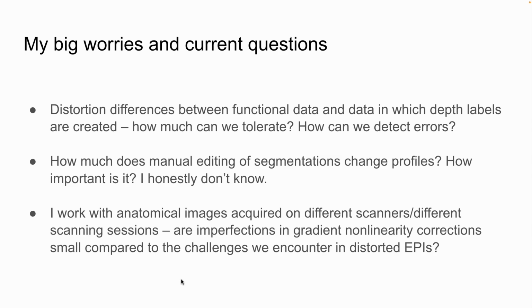And that's been kind of a guiding principle for me. And maybe it's sheer laziness, I don't know. But I've done everything I can to avoid manual segmentations of the anatomical data. Is that going to kill my career and make my results invalid for the rest of my life? I'm starting to wonder when I see all this really gorgeous treatment of anatomical data that everyone else is presenting here. So that's another worry of mine. And along the same lines, you can see all my worries are really quite anatomical. Because it provides a turnkey, reliable solution, I still use MP Rages off a 3T scanner for which the out-of-the-box FreeSurfer was optimized.